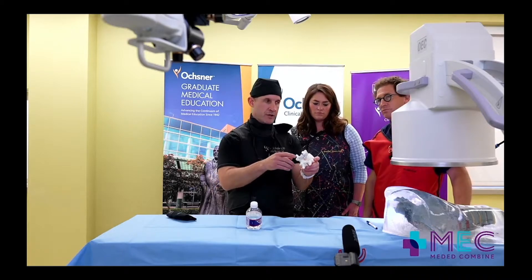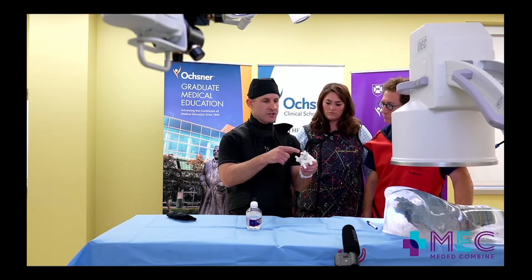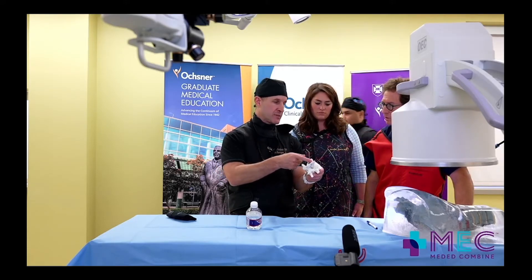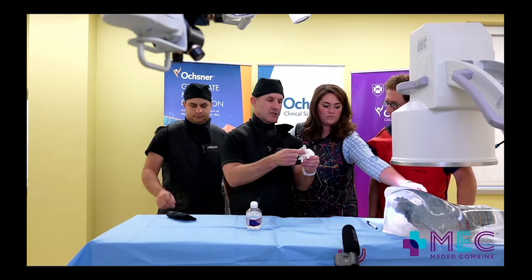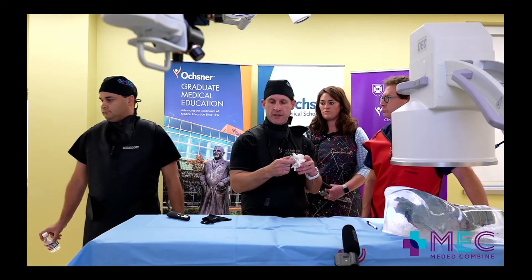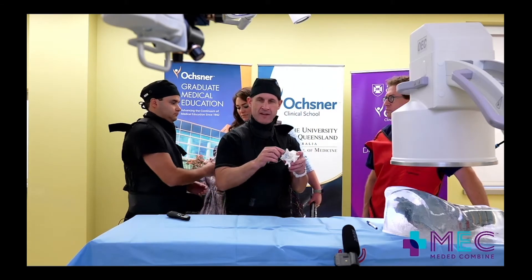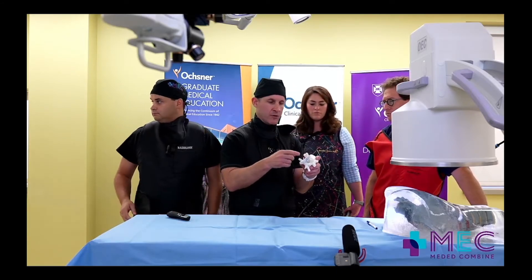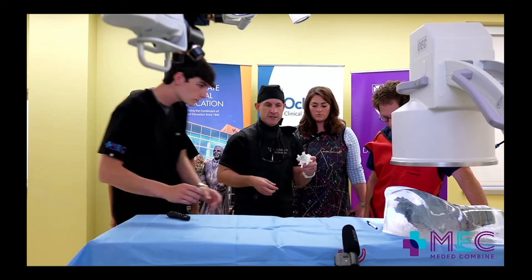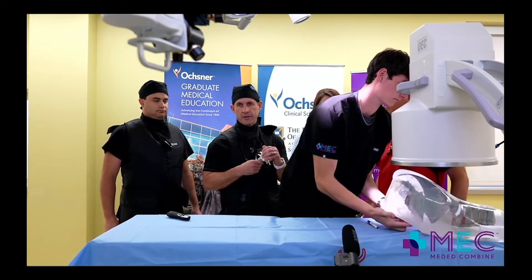If you look at this model, you'll notice — and Dr. Goodman did an amazing job going very anterior — where is the strongest part of the bone? Is it at the tip of the spinous process or right at the spinal laminar junction? Right at that junction. So we're going in very anteriorly. I'm not aware of any spinous process fractures in studies or in clinical medicine with this device because of that. Because we're coming in laterally, we're not putting any stress on the posterior element of the spinous process. So I don't think osteoporosis needs to be a rule-out or contraindication.